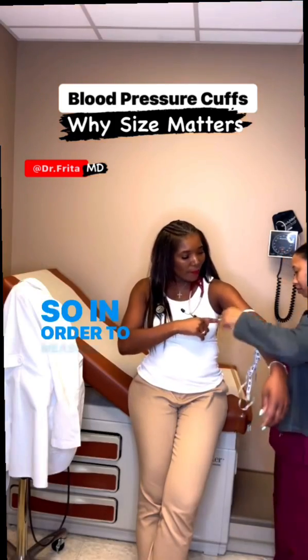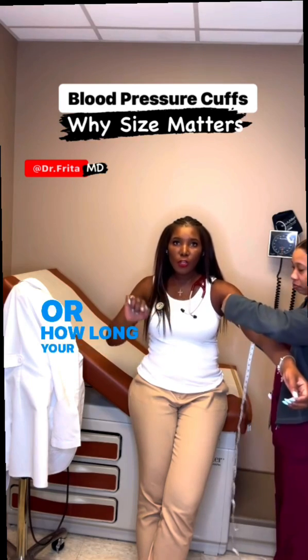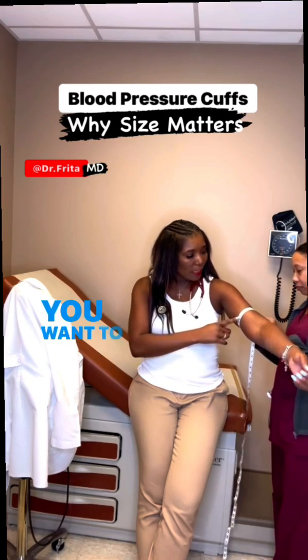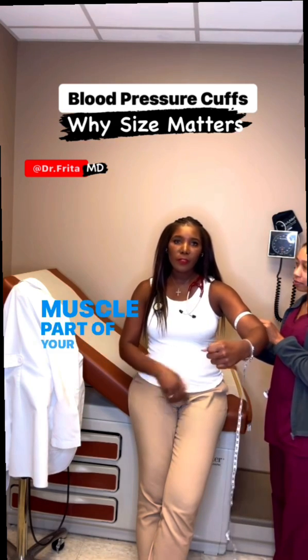In order to measure the circumference of your arm — how long your arm is when you measure around it — you want to get right into the center of that muscle part of your upper arm.